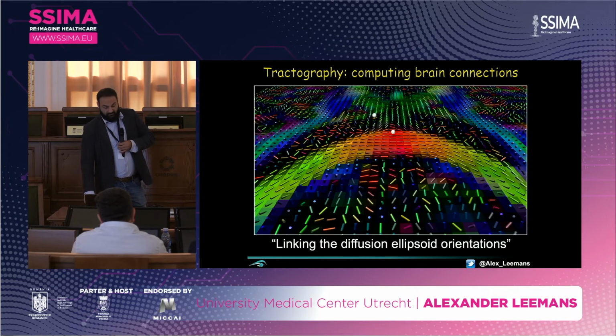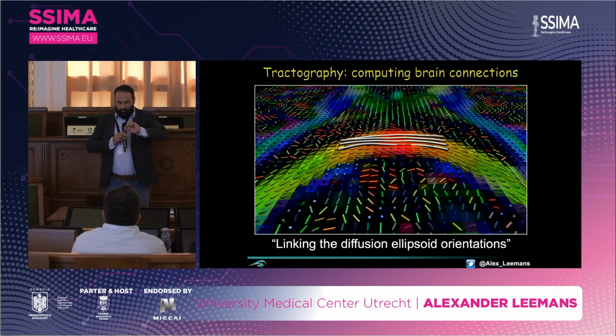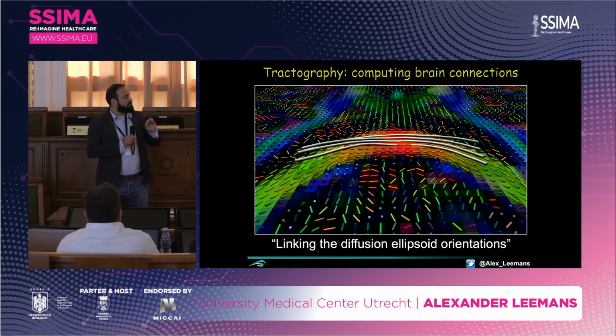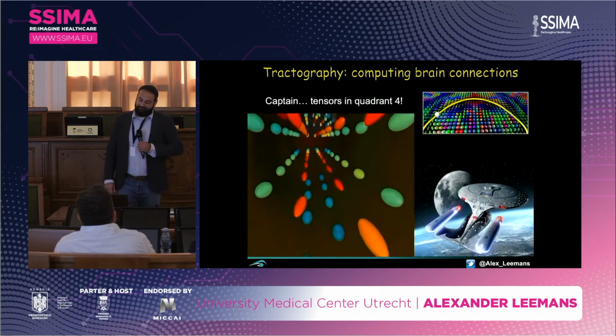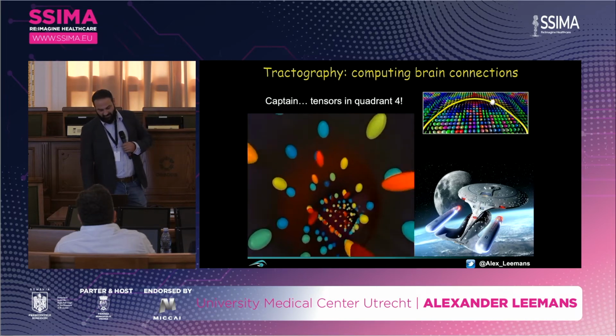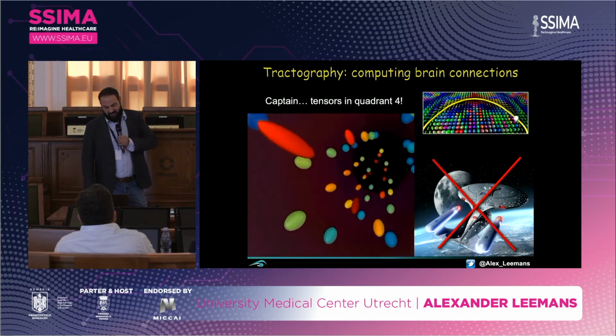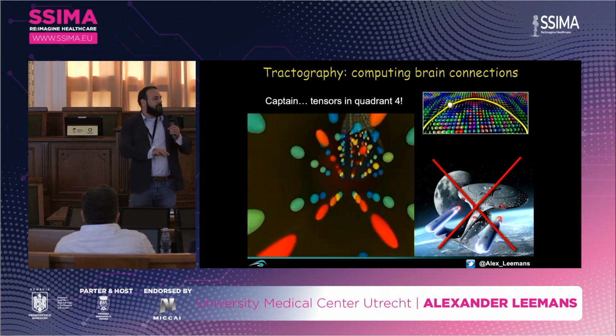So, to do that, you have starting points in your data, and then you just connect the discrete elements. And by doing so, we can now virtually, non-invasively, in vivo, reconstruct white matter pathways in the brain. Proud to be a nerd. Anyway, so for most people, this was just a wake-up call, some of them falling asleep, so that's why I put in the music.